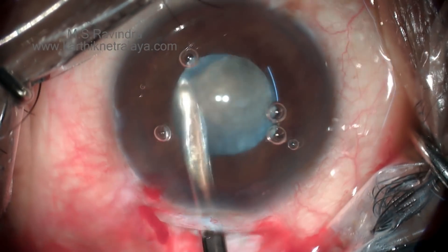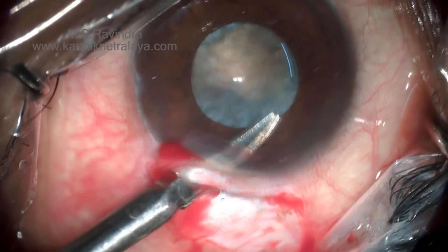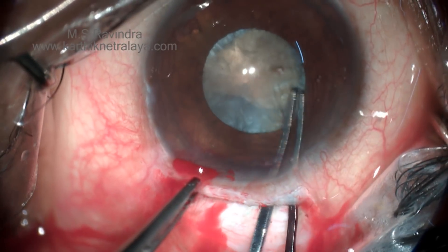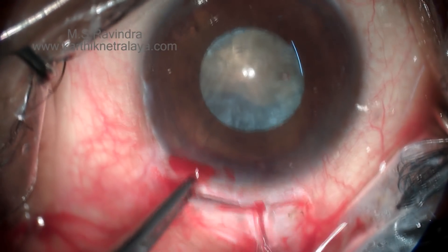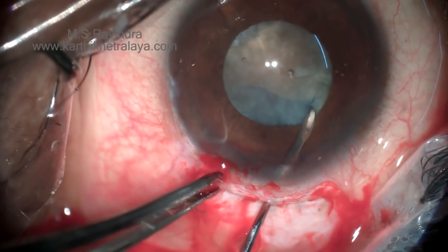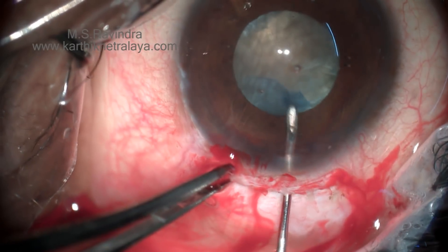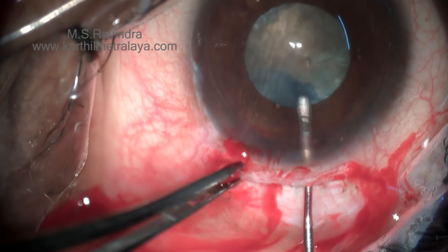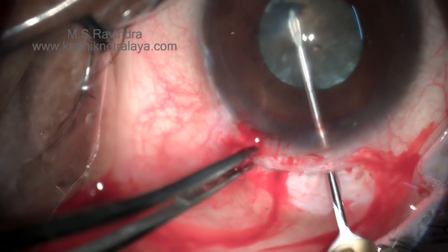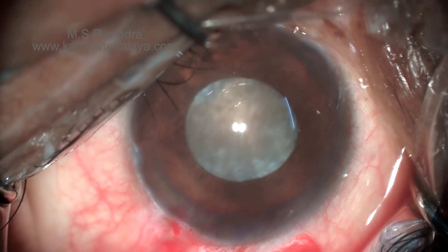Rotating the nucleus and aspirating the loose cortex from all 360 degrees will really help to deepen the chamber. It is then time to enlarge the rhexis — make a small nick. As there are no side ports, the sub-incisional capsule can be enlarged by the cystitome. Make an entry not exactly at the capsular margin but a quarter millimeter inside, and you can create a dog-ear-like flap which can be extended using the cystitome, giving an adequate-sized capsular opening.